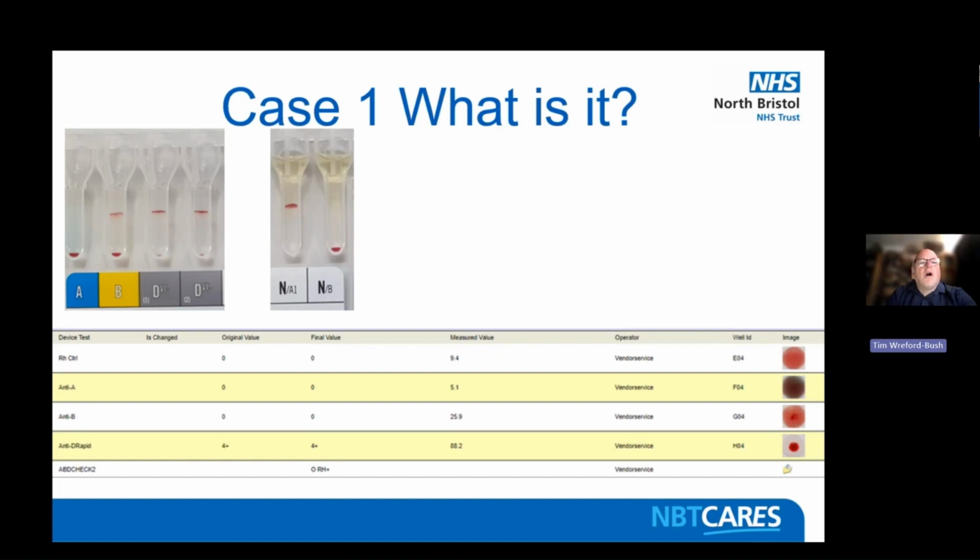Then you've got the D. You've got a lot less at the bottom. And you notice in the B, you've got sort of 50-50. So what this is, is a B patient that has been given O negative blood. There's only a small amount at the bottom. I think what's happened is some of the D negatives have come through, but some of the D negatives are probably caught in the top as well. So you've got the D positive that's caused such a mess up there. I think it's actually holding some of the D negative cells through as well.